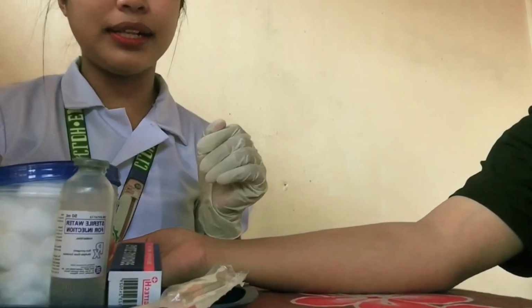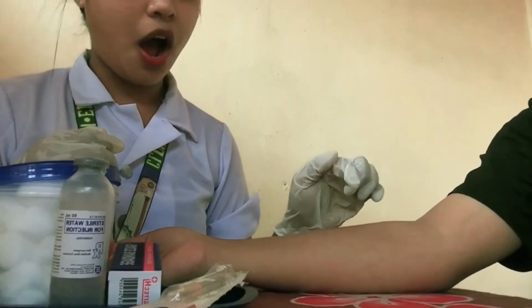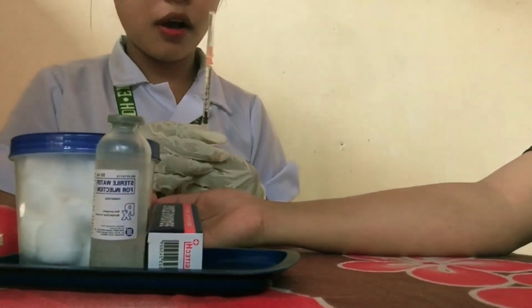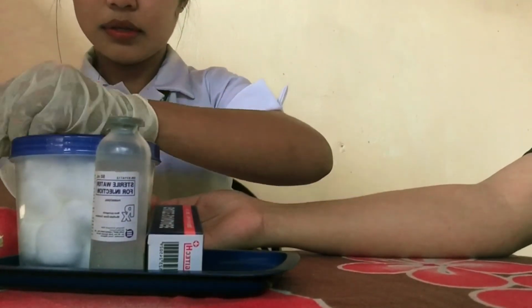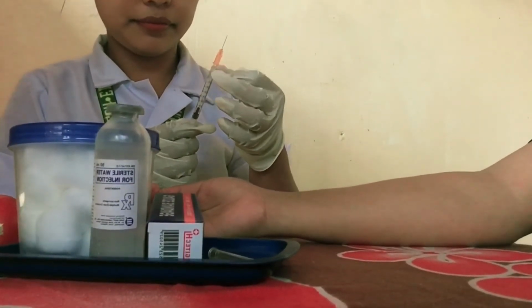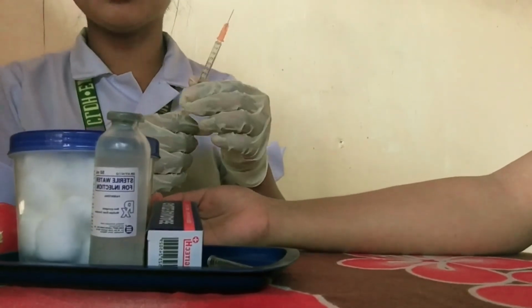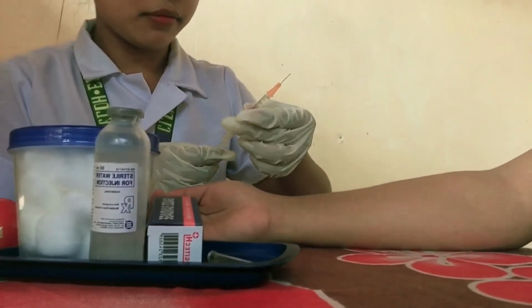And while waiting, we will prepare our syringe that we will inject into the arm of our patient. So now we will get our syringe and remove the cap. If there are bubbles, we need to do this to avoid that. After that, I need to grasp the syringe between my thumb and two fingers and place it parallel to the skin surface.